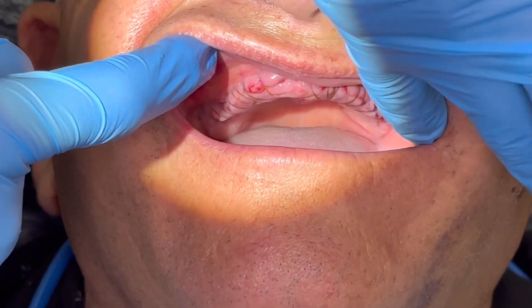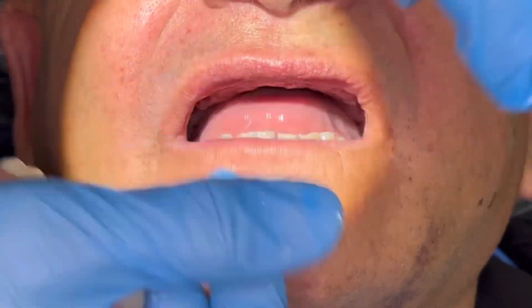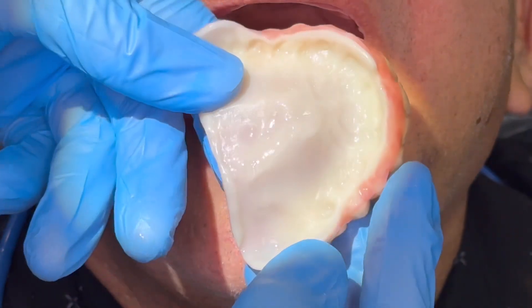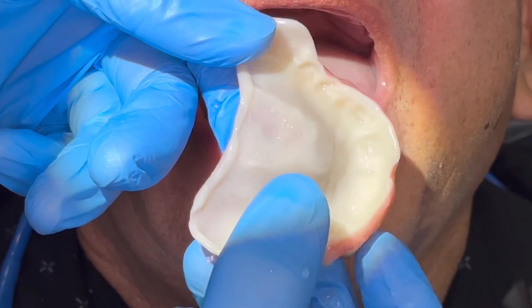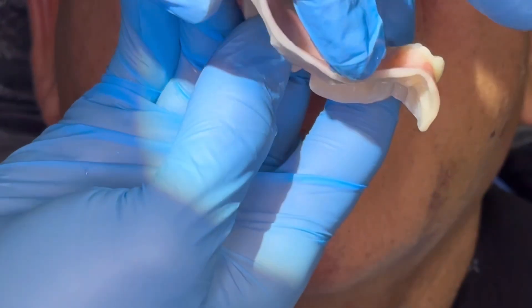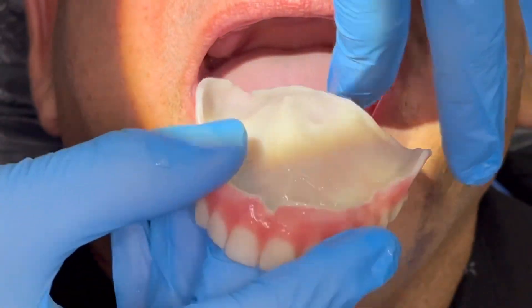You'll see the borders on this denture — they have a really great adaptation, and that's a technique we have worked out using a Wagner tray, which we captured at the time of surgery. You can also see the nice posterior palatal seal we have there.